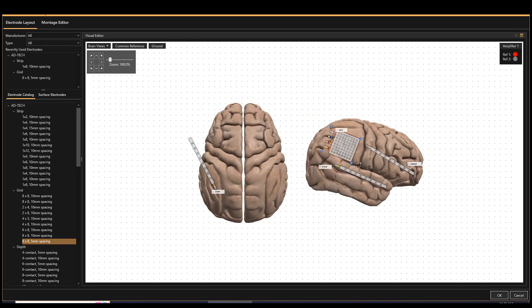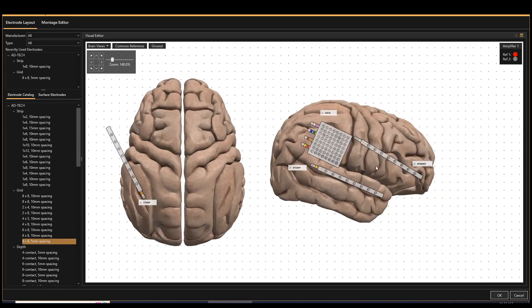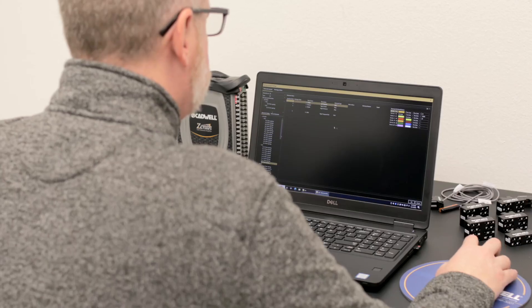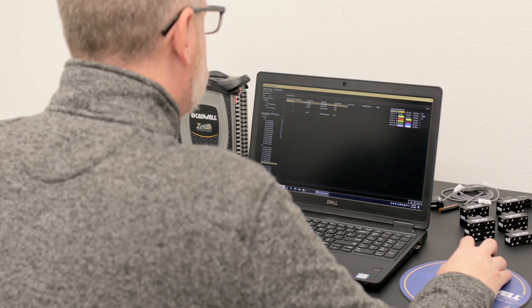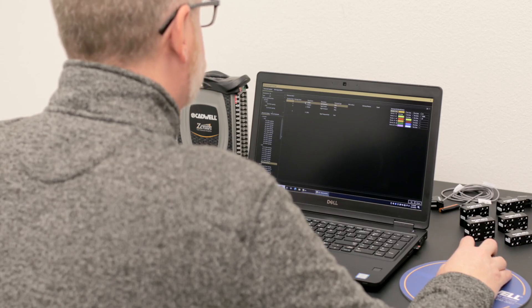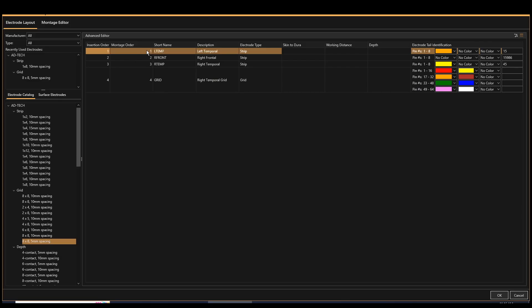Automatically generate montages based on your preferred montage layout. You can make changes on the fly to the recording montage without stopping the recording or physically switching any electrode inputs.